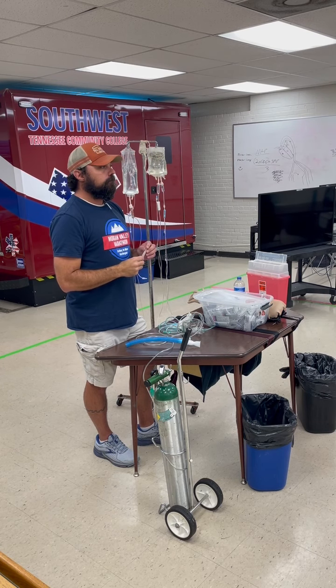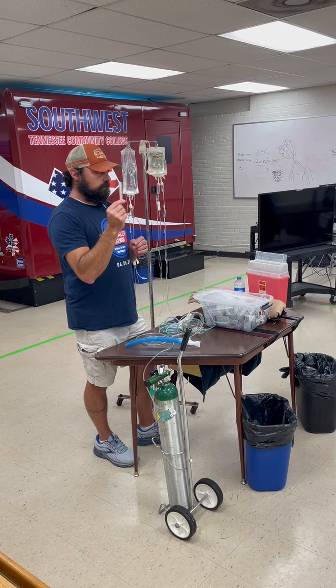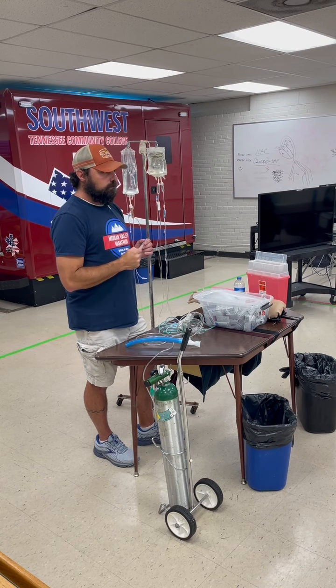2.5 milligrams. Mixed in? Saline, but I don't know how much. Anybody? 0.3. Okay, so it's 3 cc, 3 mLs. 3 cc's or 3 mLs, but cc's and mLs are interchangeable.